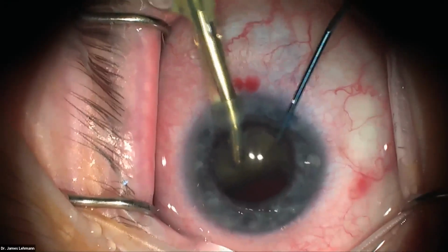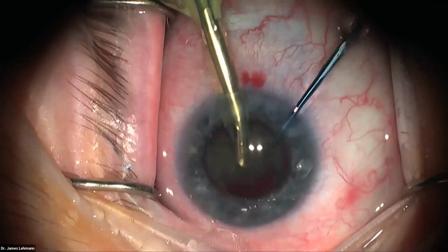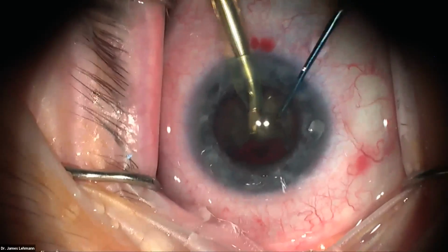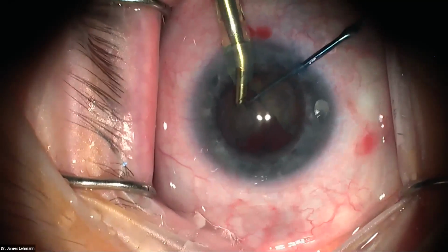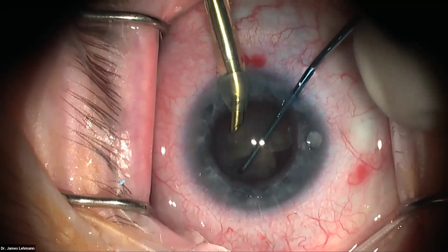Now I'm going to bring it up. And now I have moderate power. It's not that dense. There was a PSC element to it. And I'm trying to eat it in the iris plane, keep it centered in the eye, away from the iris, with minimal power. And I use a burst mode so that it kind of keeps it dancing on the tip.